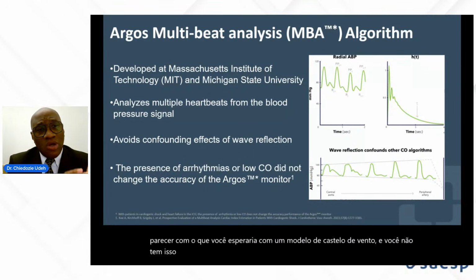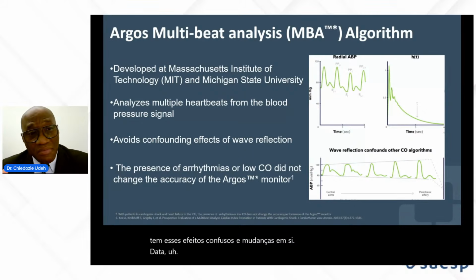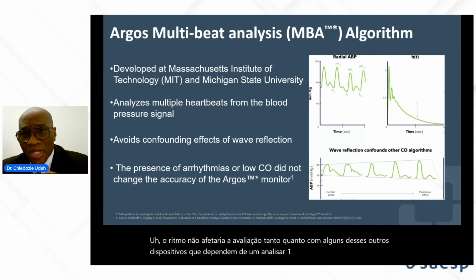And so changes in rhythm would not affect the assessment as much as with some of these other devices that depend on analyzing one single arterial waveform.